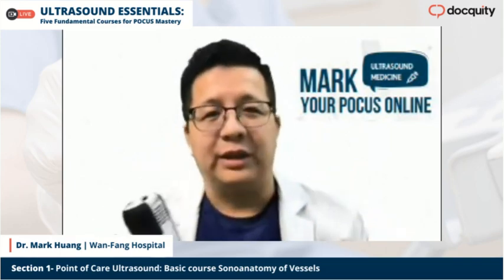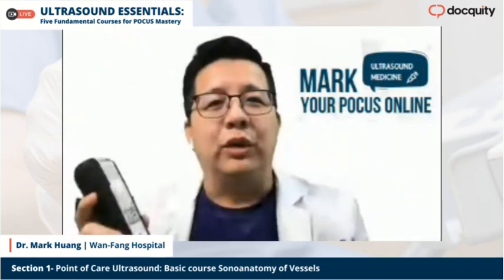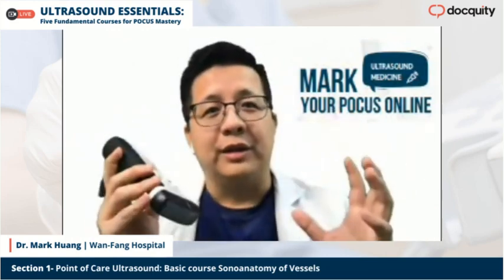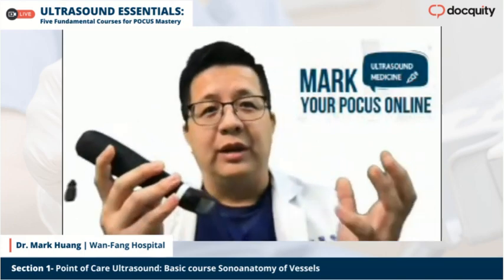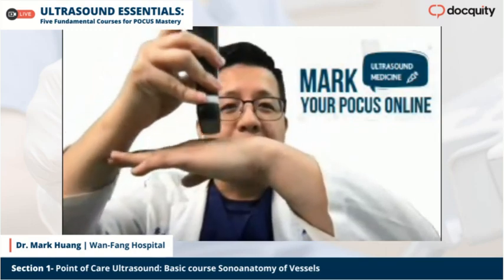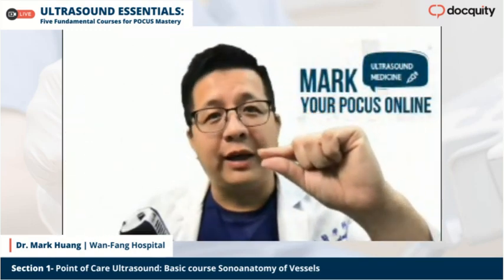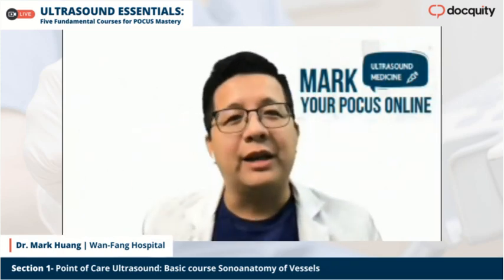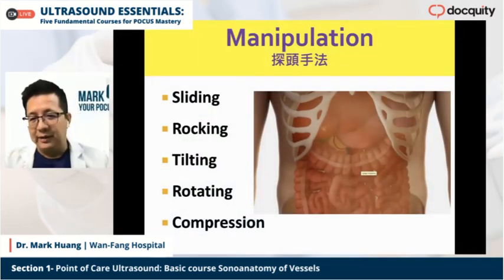It's very important. The final thing is compression. Under ultrasound, some structure could be a vessel, and it could be a low-pressure vein. When you give it some pressure, the vein will collapse. It will help us to identify the structures easily. Okay, so let's finish the major skills. Jessica, let's turn back to our slides.